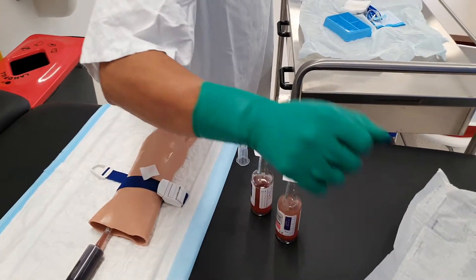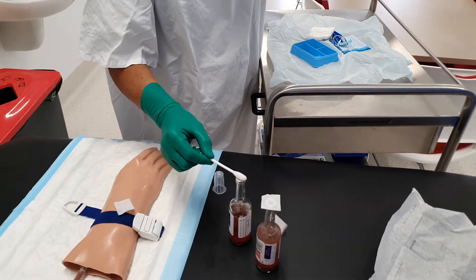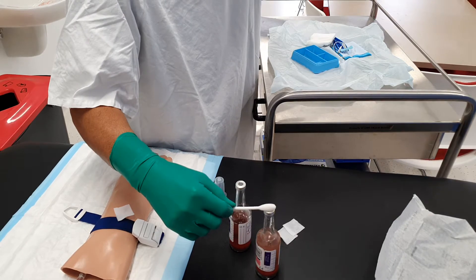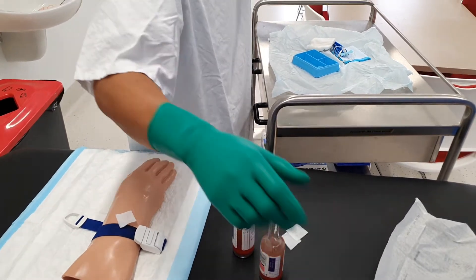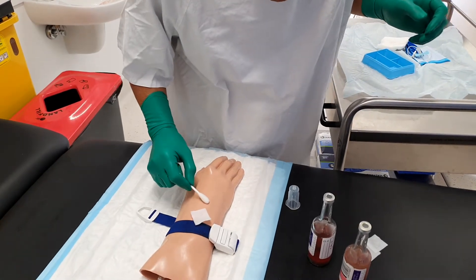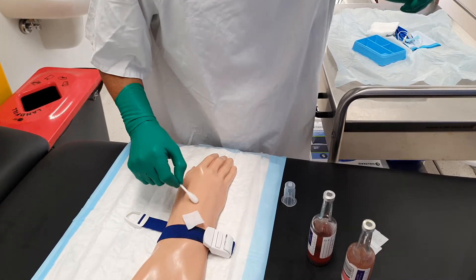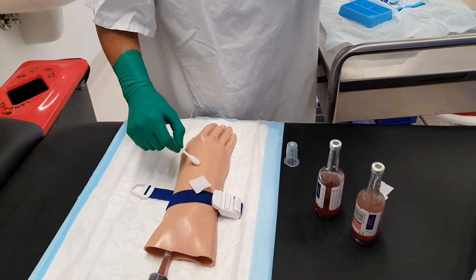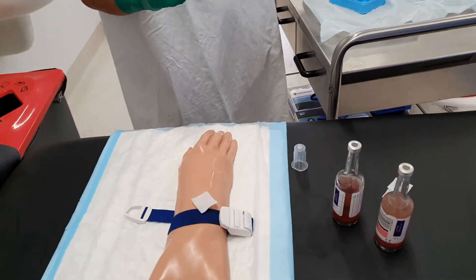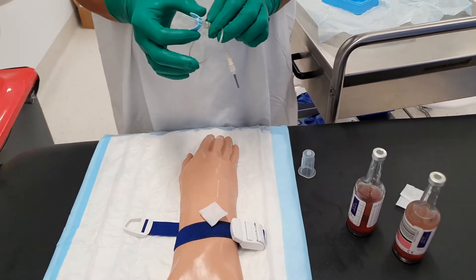So there are three swabs. The first swab I'm going to use to clean the area. The second swab I'm going to use to clean my bottles. The third swab I clean the area a second time, and what I'm doing is palpating the vein to help me locate it — but this swab is actually pointing to it now, so it stops me from over-touching the area.